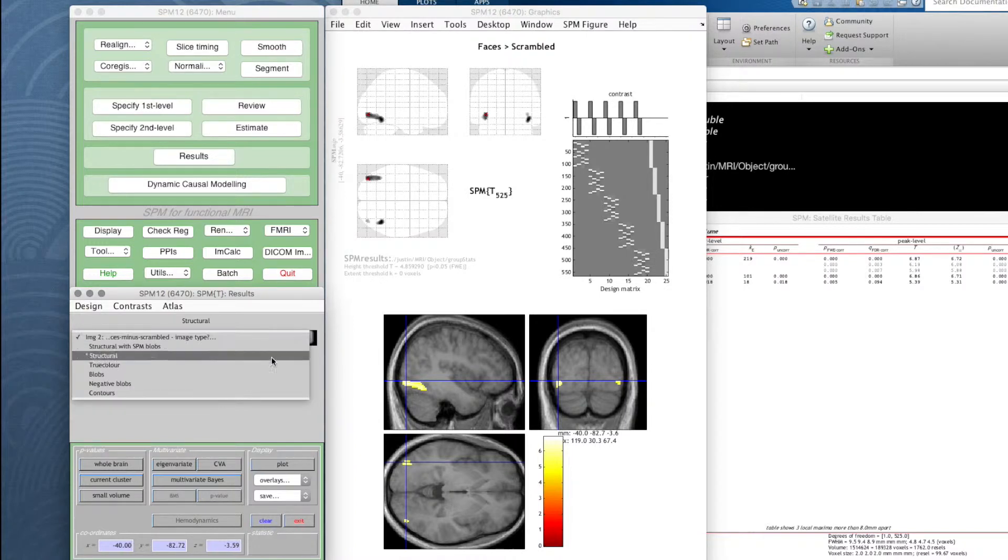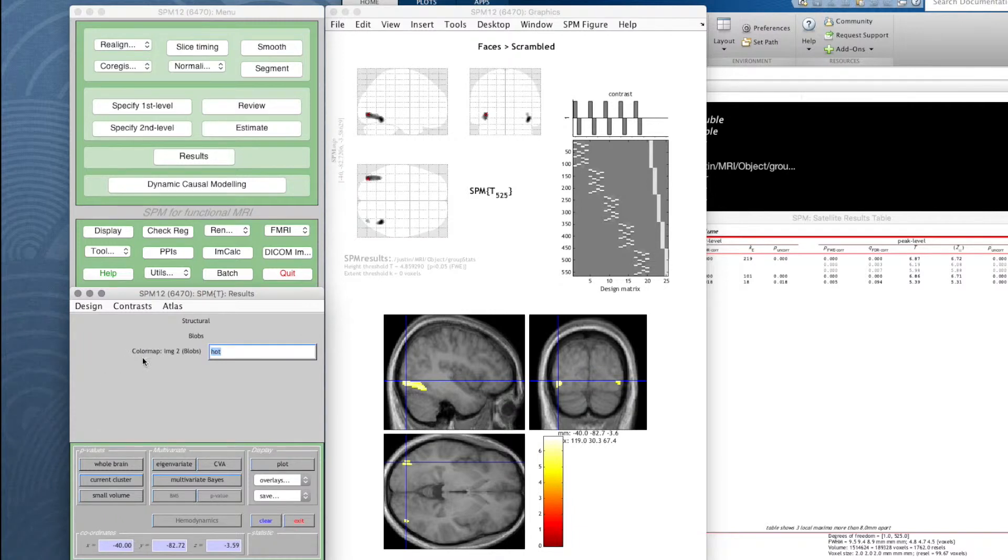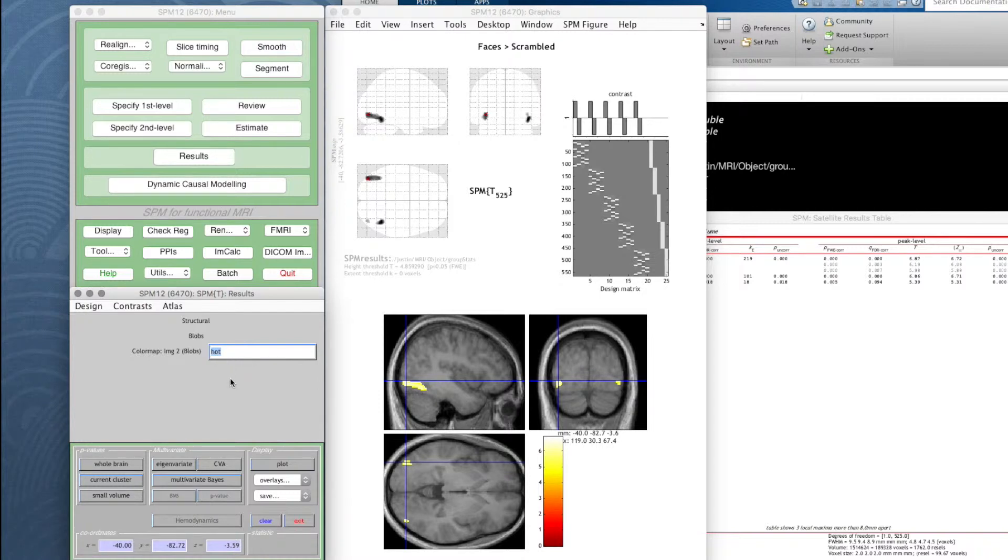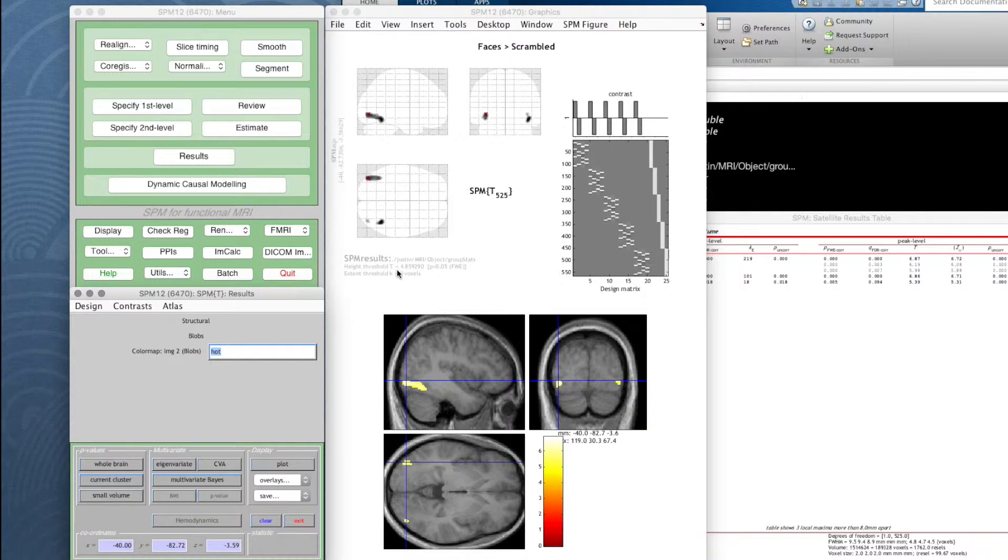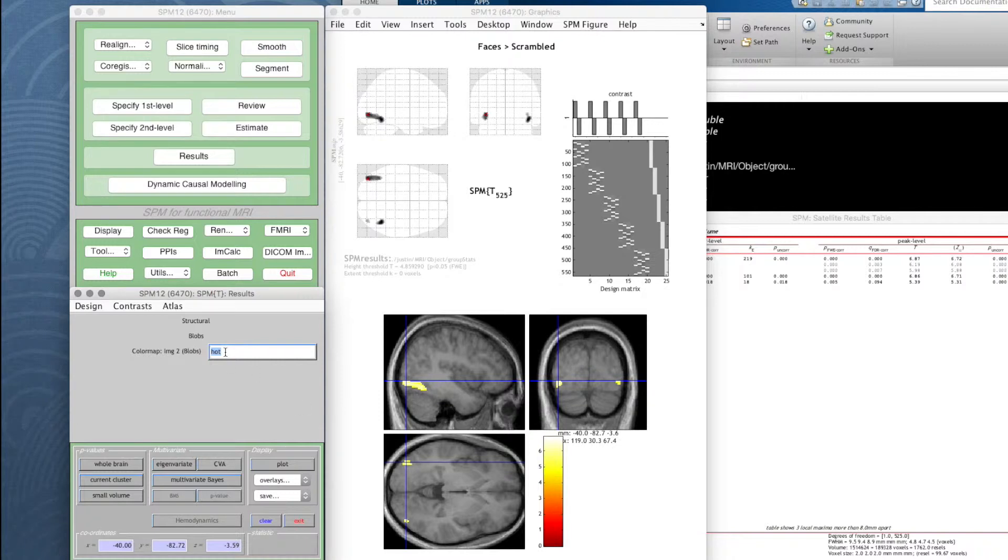It says color map for image two, which are blobs, and the default is hot. This is the color scale it's going to use here. We've got a red through white color scale for the t values, and our t values are all above sort of five-ish, so they're all bright yellow through to white. But we can't use exactly the same color map for two different blob sets or we won't be able to tell which is which. So what it's asking for is the name of a MATLAB color map.